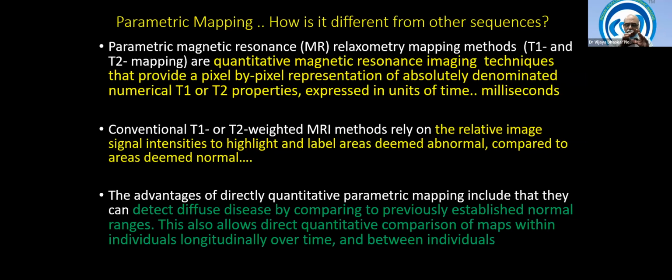Normally, all the protons align themselves in one direction when subjected to the magnetic field of the MRI. They are put in the MRI magnet. Once an inversion pulse is given, they are disturbed. They flip from their normal position to another position. Then you stop the pulse, and they come back to their normal position, that is the equilibrium position.